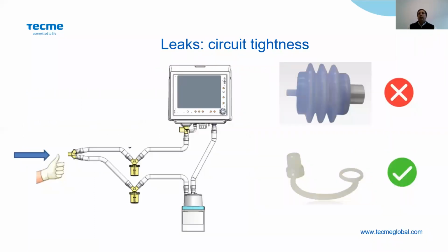In order to do this initial calibration, I will have to block the Y connector. We provide with the machine a cap in order to plug it in the Y connector and to close all the system.